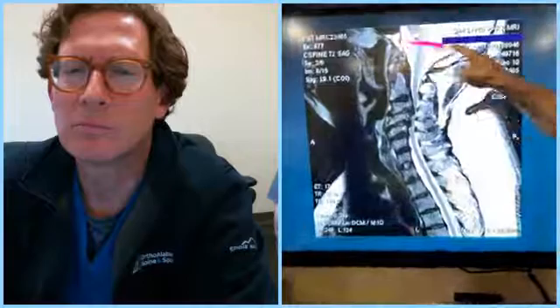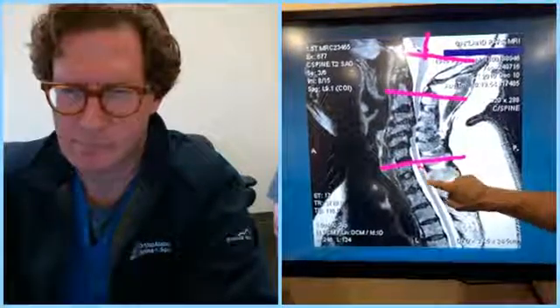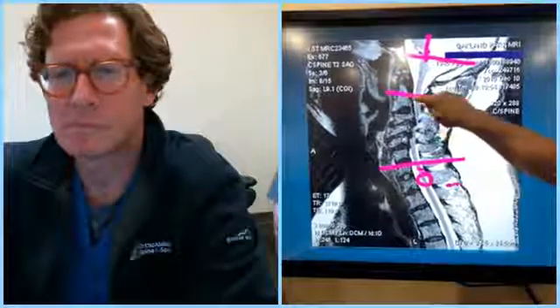Hang on. Got it? So if you want to look closely, here's the base of the skull, the bottom of the skull. The brain is anything above that. The spinal cord is this structure here, and it is totally pinched there at C3-4, C4-5. Correct. Below there it's good. Above there it's good. So the middle section here is pretty severely compressed. Clearly you can see around the cord is water, space. So around the spinal cord is plenty of room. Here what we have is bone growing into the cord and pinching the nerves.